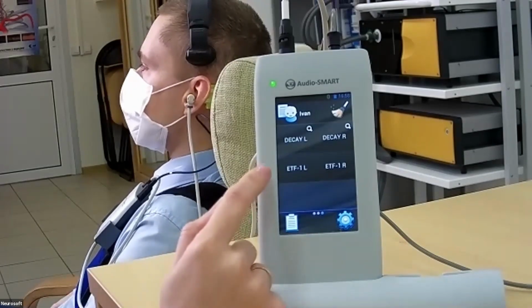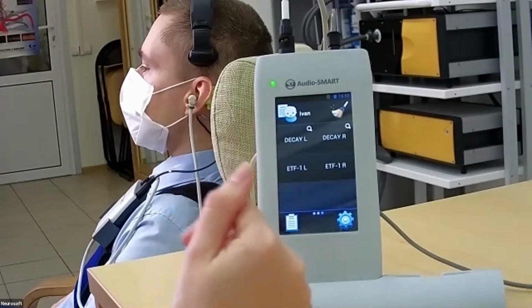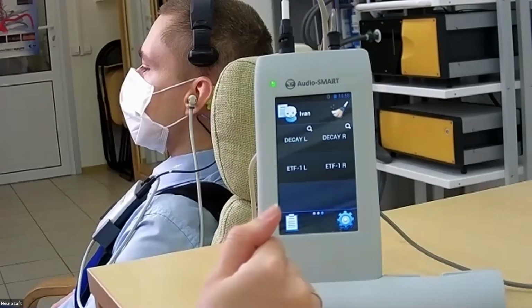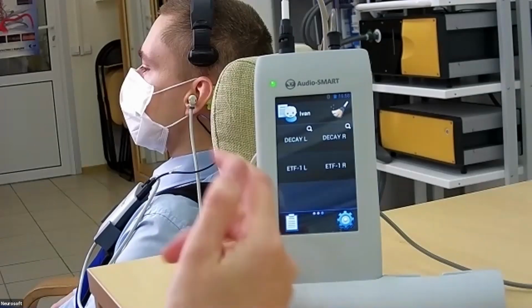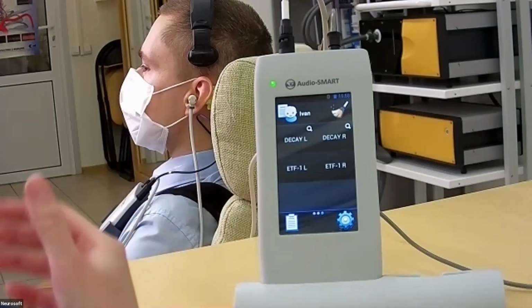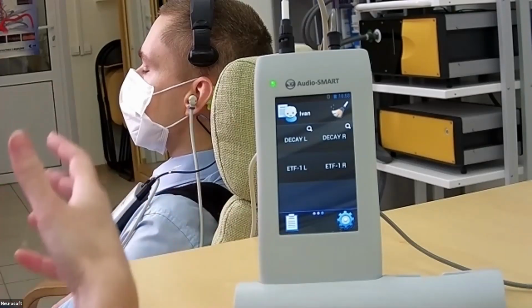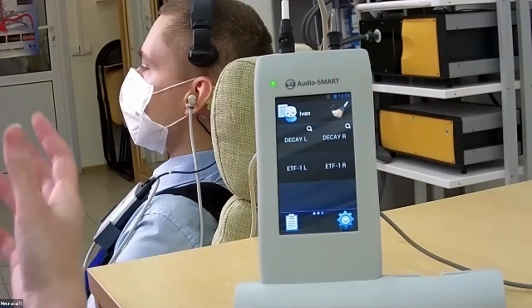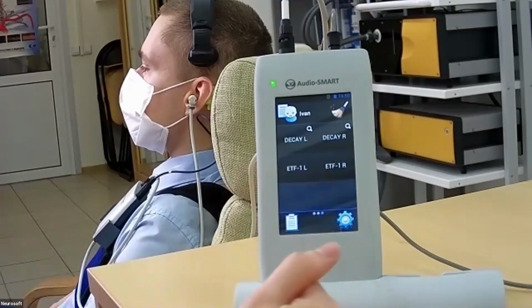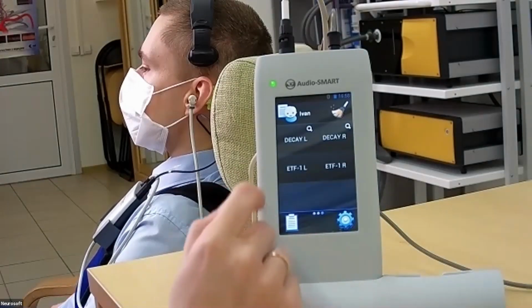Now we will go ETF on the intact tympanum, as Michael said before, ETF1, and it requires the instructions of the patient, what to do during the test. And the device will help us with the helping windows. So let's start.